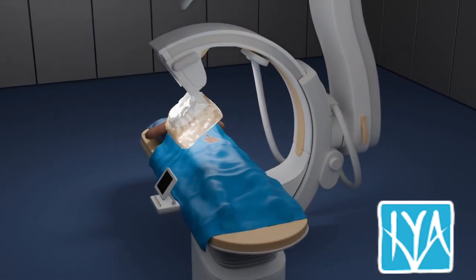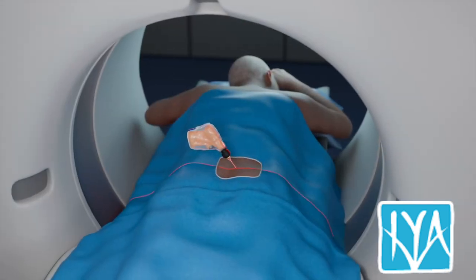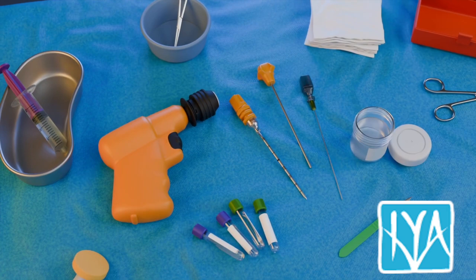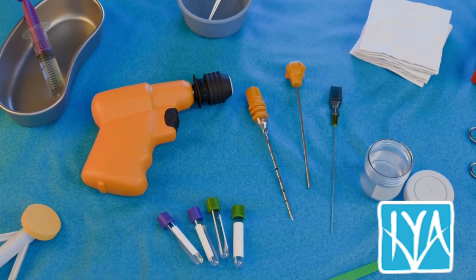Fluoroscopy provides real-time visualization, making it ideal for faster procedures, while CT guidance offers higher precision, especially for deep or complex biopsy sites. This animation demonstrates the step-by-step process of performing a bone marrow biopsy using a bone biopsy needle under fluoroscopy and CT guidance.